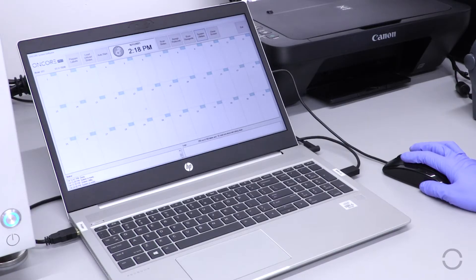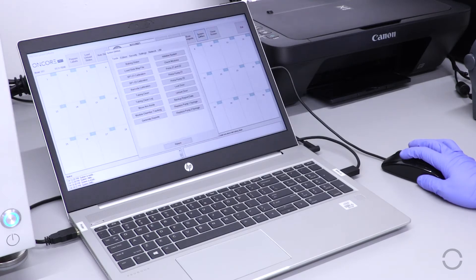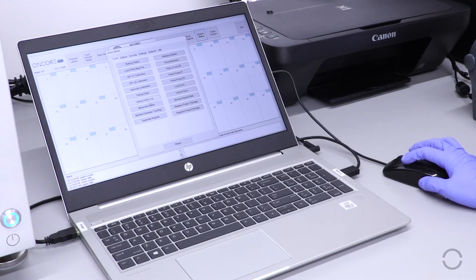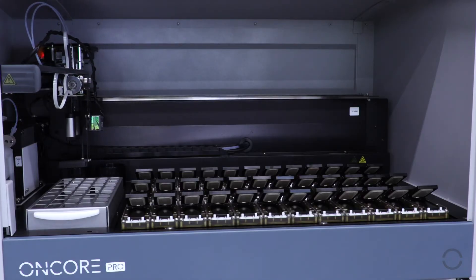To remove the Encore Pro Reagent Tray, first move the Z-Head aside by going to System Utilities and selecting Move Arm Aside. The Z-Head robotic arm should move aside.